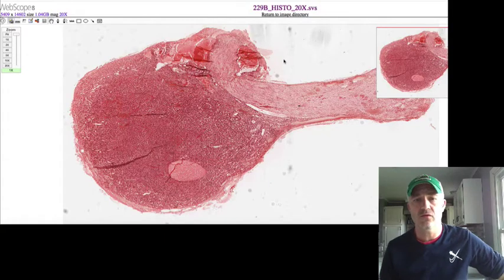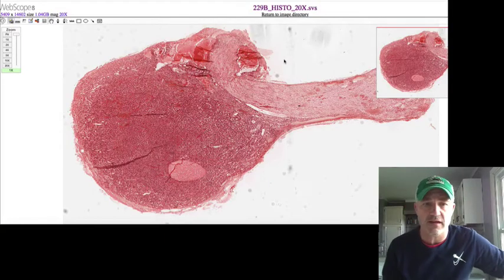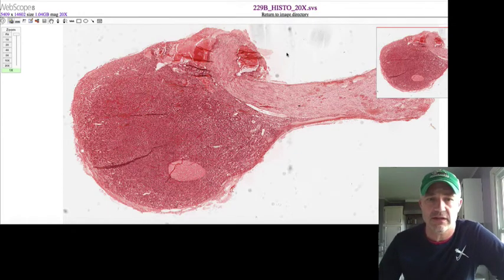So what we'll take a look at on the slides here is we're going to look at the anterior pituitary and make sure we can identify those different cell types, anterior versus posterior pituitary, and some of the basic structures of that as well. Two quick looks at a couple different slides here to look at the pituitary.